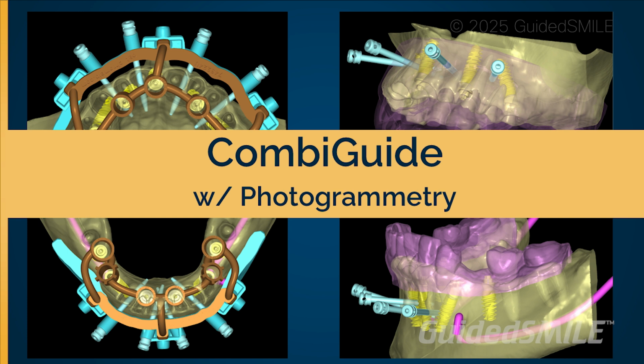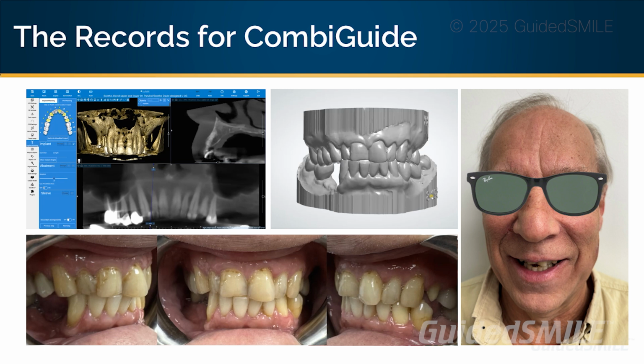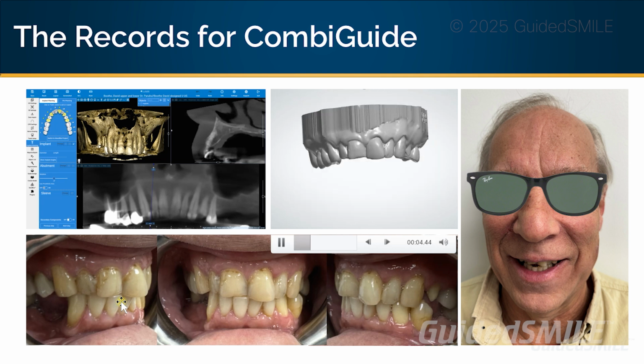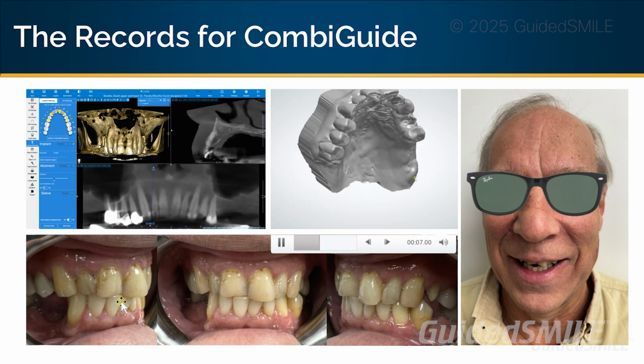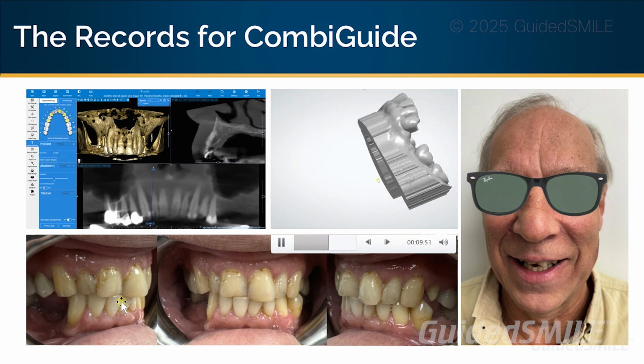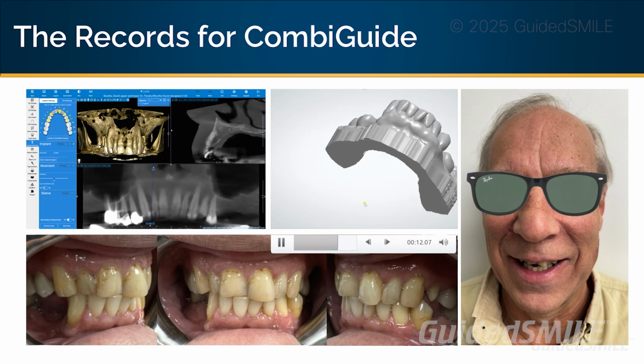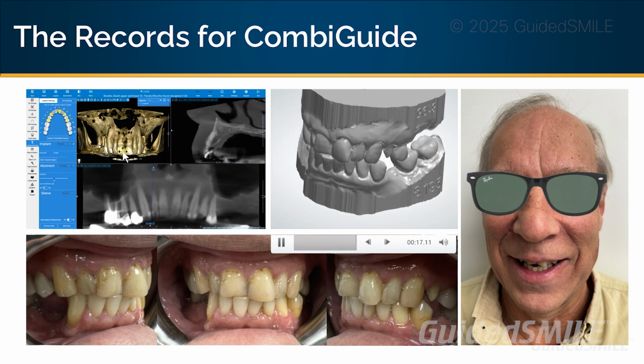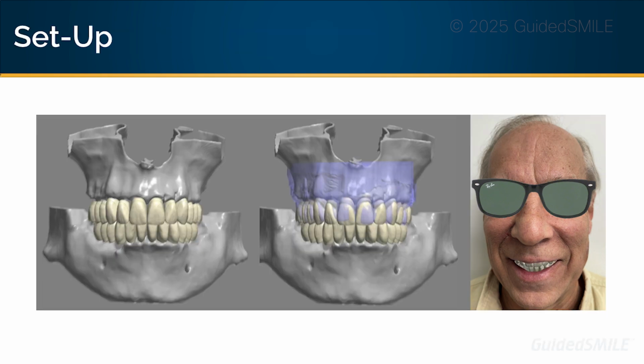So let's go through the process of doing a CombiGuide. Now, these are the records, which is a full face, full smile. We like to see the photos of the teeth together in bite retracted so that we can make sure the case is articulated properly. And this, of course, can be a digital process. Upload your iOS scans or Stonecast. Either way, we'll work with either type, of course, and then capture a CT scan. This is a double arch, so this would have been a full volume, and then we'll separate. And then, of course, always a teeth apart if it's a dentate patient.